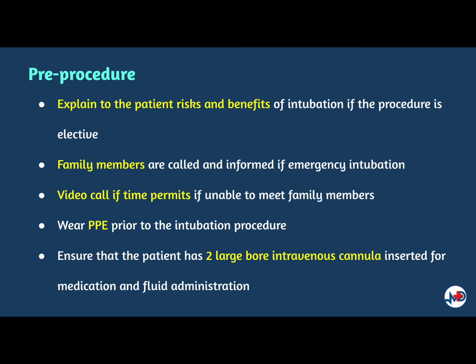Ensure that you wear your PPE prior to the intubation process, and ensure that the patient has 2 large bore intravenous cannulas inserted for medication and fluid administration.